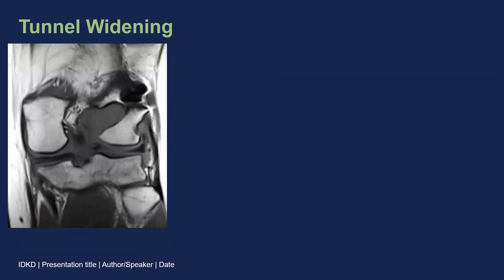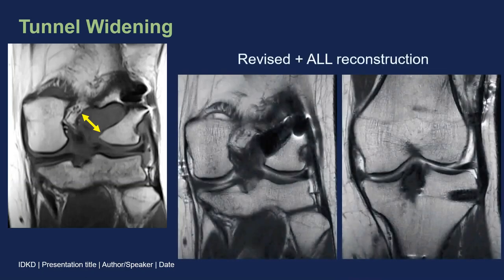You want to make sure you look for tunnel widening and measure it at its maximum diameter perpendicular to the long axis of the tunnel. Widening is not necessarily abnormal and doesn't necessarily mean that the graft has failed, but if the graft has failed, the surgeon wants to know because it will affect the revision procedure. The graft, if the tunnel is wide, may need to be bone grafted in a two-step operation. In this particular case, when the surgeon revised this failed ACL, they used an extra-wide interference screw to fill the femoral tunnel and then supplemented the operation with a reconstruction of the anterolateral ligament.